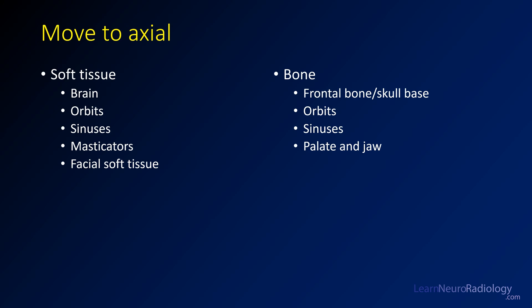Once you've gone through your coronal search pattern, I recommend going into axial. On the axials, take a similar approach to the coronals: look at the soft tissues first working down from the top — brain, orbits, sinuses through to the masticators and parapharyngeal space and facial soft tissues — then go back through and look at the osseous structures.